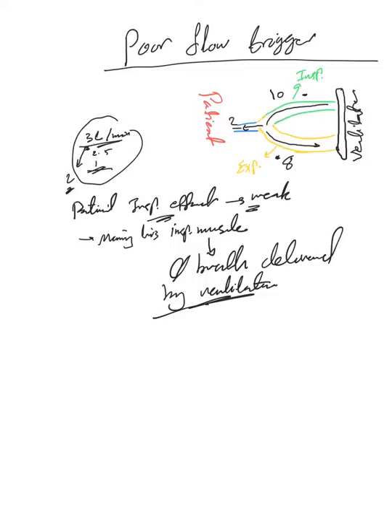So you're looking at the patient, he is trying to breathe, he's moving his inspiratory muscle, but no breath is delivered by the ventilator. So you lower the threshold, and that hopefully will solve the problem. That's one thing. So how do you identify it? Or before how do you identify it, another scenario I want to make you aware of is nebulizer treatments.